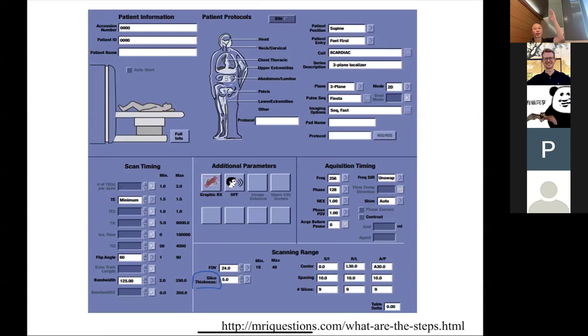The ordering can be different. We can go sequentially, or sometimes we'll do all the odd slices and then come back and do all the even slices. There's even new methods now where we can do 3 slices simultaneously, but these are all ways of doing slice selection. So that's in the realm of what we call 2D imaging.